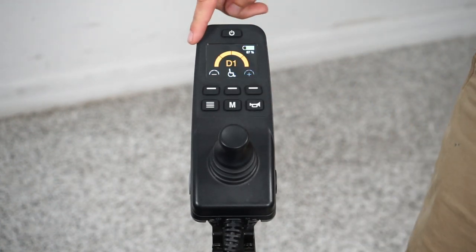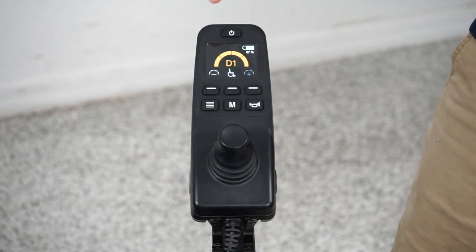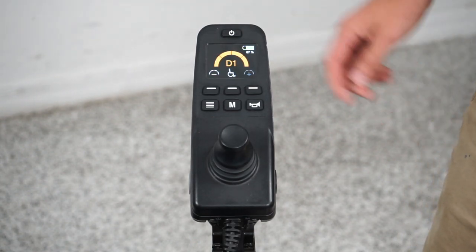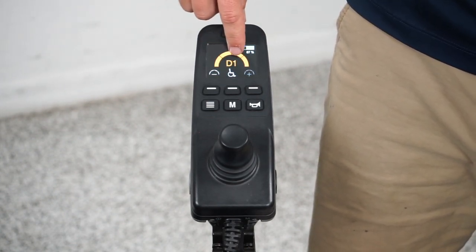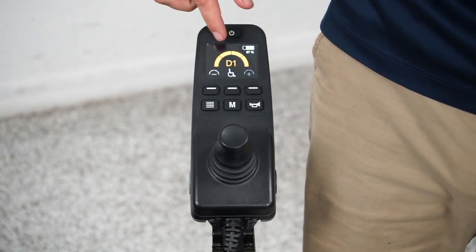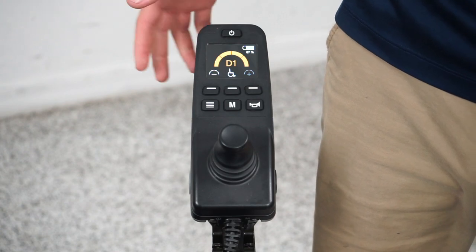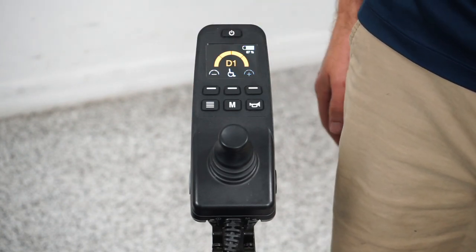Now I'm going to go over the display. Up top you have your battery indicator — right now we have 67% of our battery life left in the chair. This is our profile: we're in drive one. There are four profiles in total. Drive one is the slowest — kind of your indoor slow speed — and it maxes out around one and a half miles an hour.